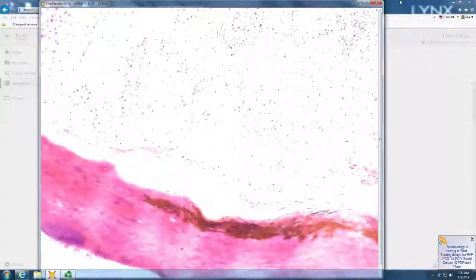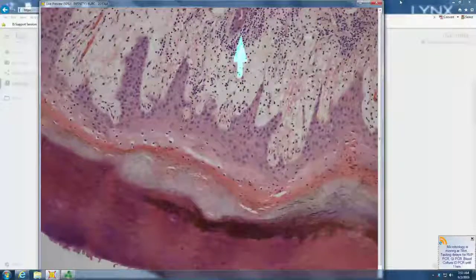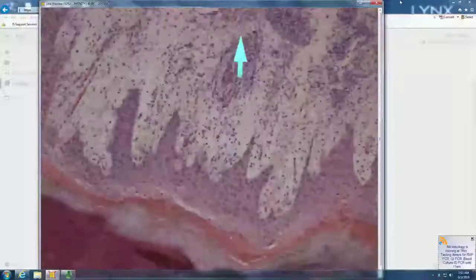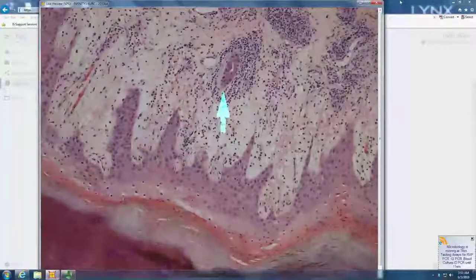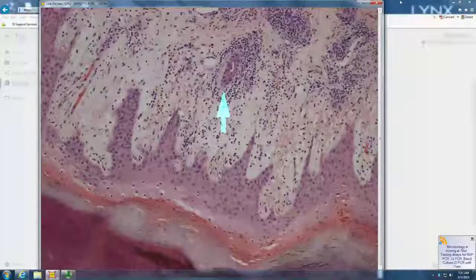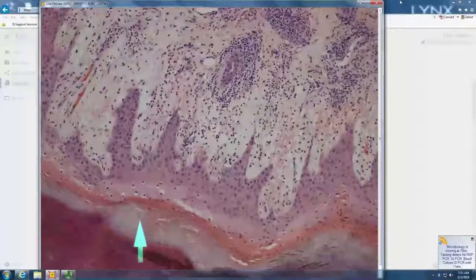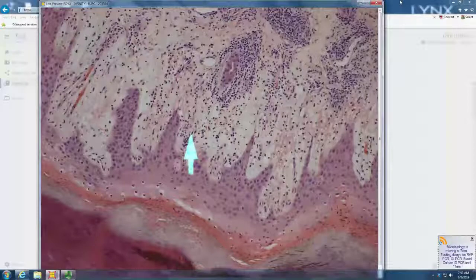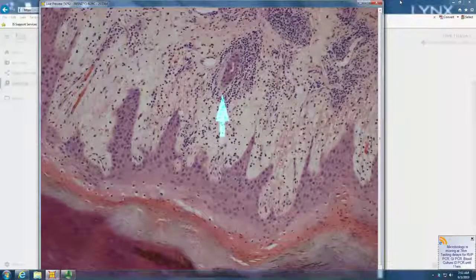Okay. So here, every lymphocyte has a little bit of white around it. They all sit by themselves, whereas in most infiltrates, they kind of overlap and cluster, right? Very characteristic of PMLE, of perniosis, acral skin, papillodermal edema, every lymphocyte surrounded by a little bit of white.